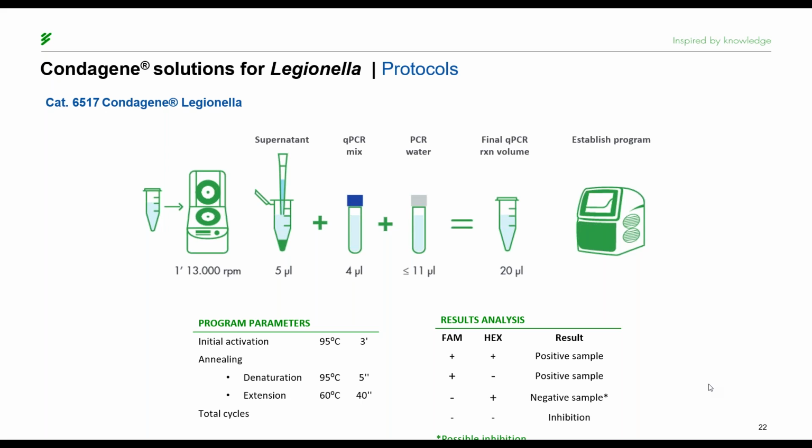But for example, if we had a negative PCR with a positive culture, we could be talking about possible contaminations or some problems that have occurred, an inhibition in the detection of Legionella, but that the PCR works well. And if both channels are negative, it means that some problem has occurred and the reaction is being inhibited.